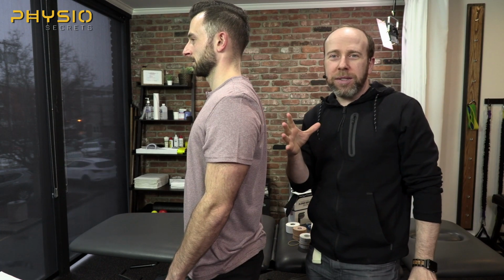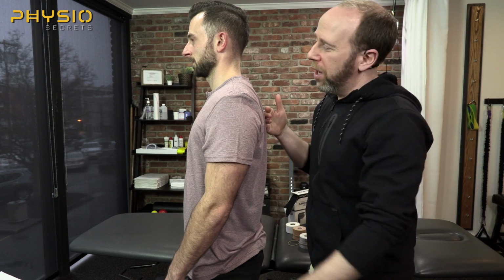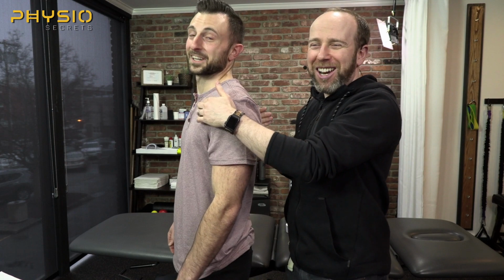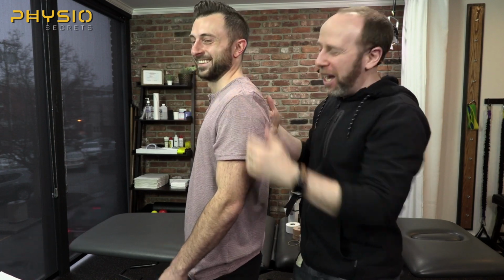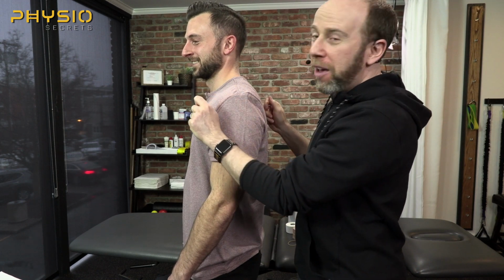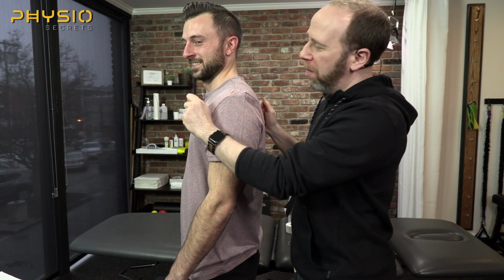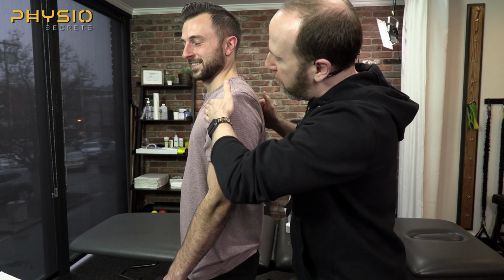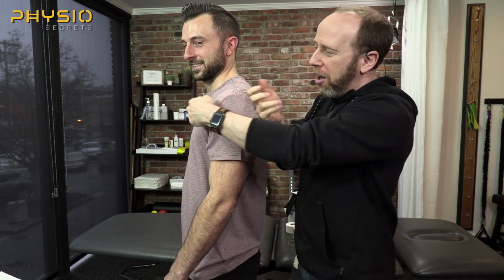So here's the thought process. If I'm applying the tape, he's got chest hair, right? Yeah, probably too much, right? So if I apply the tape from back to front and I put some stretch on the tape and I start to wrap it around, but I've miscalculated where the tape's going to end up, I'm going to end up right on top of his chest hair. So guess what's more convenient and smarter? For me to start the tape in the front, lateral to the chest hair, and then wrap it around the backside. Because I don't care which direction it's pulling in, because when I apply it is the only time he's ever going to feel that.